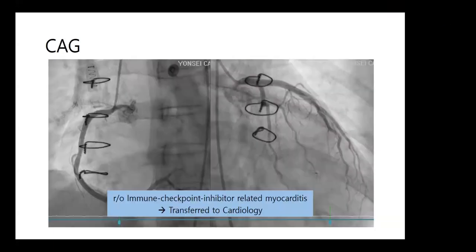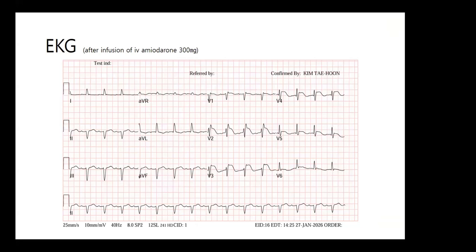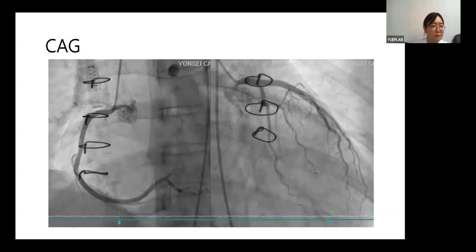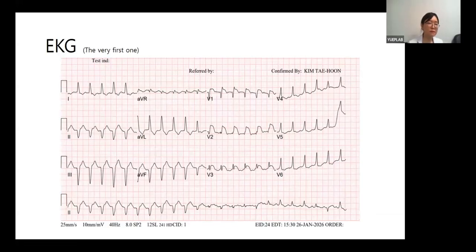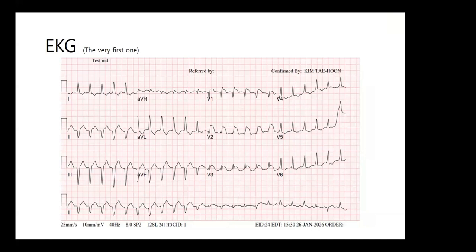Dr. Bob, can you hear me? Yes. Is it possible that the patient had an acute reaction, developing acute myocarditis? Yeah, I think so. Acute myocarditis, microcirculatory ischemia. I think that looks like what's going on here. Troponin is elevated, and all that is consistent with it. And again, when you look at an acute anterior MI and you have a deep S wave in V1, you need to watch carefully to make sure that it is not global or two-territory ischemia. Sometimes we miss the diagnosis.